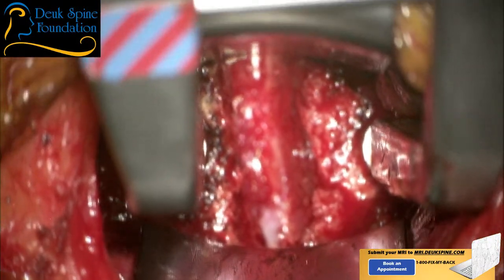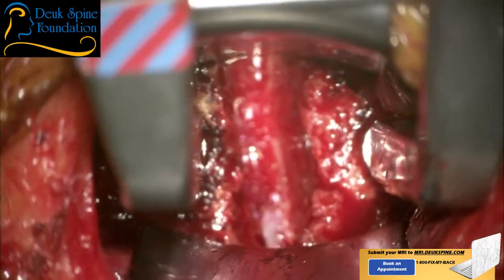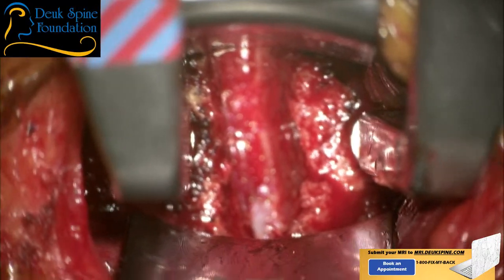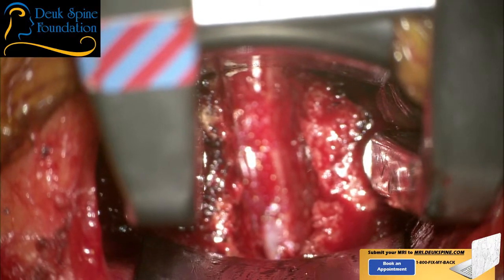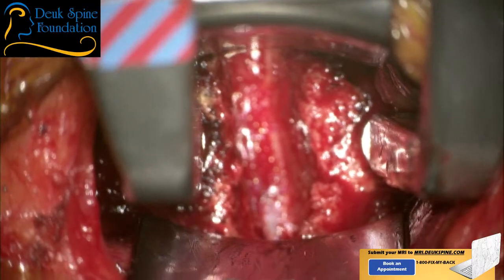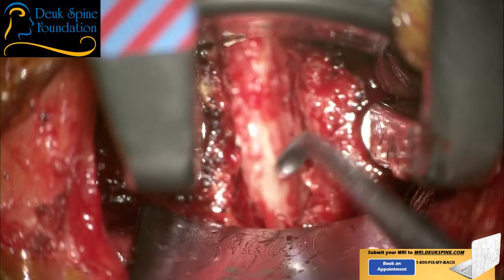All right, that's good. Go ahead, Dr. Patel. So at this point, I've adjusted the zoom and magnification and the amount of light intensity as well as the focus, all right? So zoom, which is your magnification, and the focus, and the light intensity. Can you see okay there, Sean? Yes, it looks good.